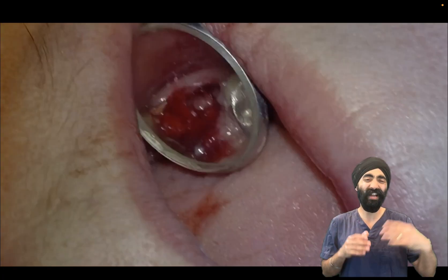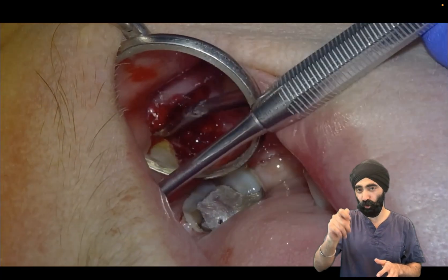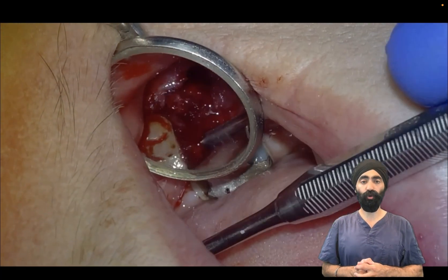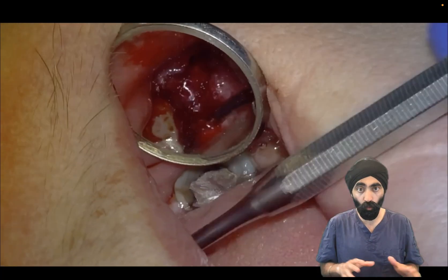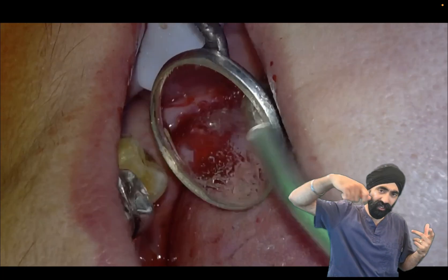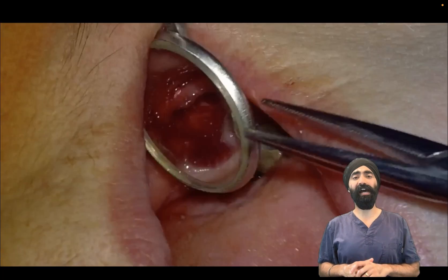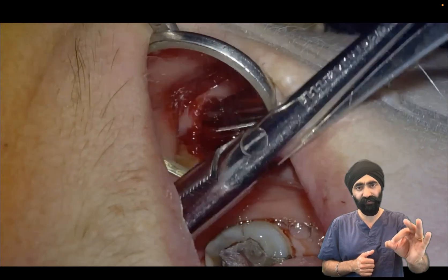We have done our extraction. We now check: is there any debris? We see some debris, some calculus, and I see some infection there, so I'm going to scrape away that infection and get the socket nice and clean. I'm going to make sure there's no bony fragments or toothy fragments in there. I'm checking for an oral antral communication and there wasn't one — happy days. To grab onto that infection at the base of the socket, I use some needle holders just to get right to the base and take it out. We want a nice clean socket; you need good magnification and good lighting to do this kind of work.